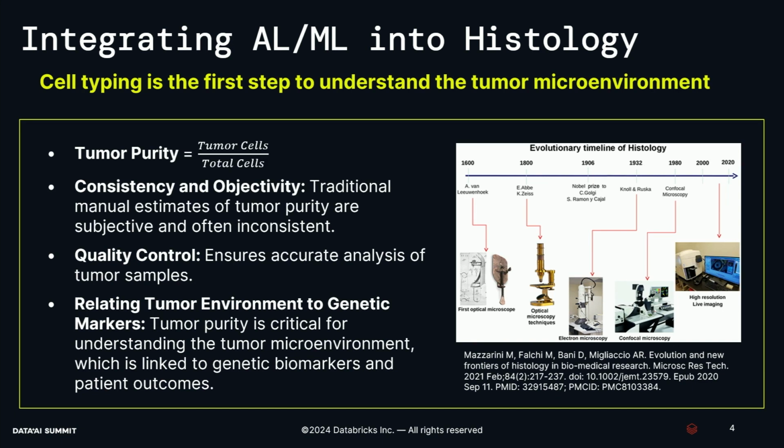And for us, we're trying to get into digital pathology and digital histology, and we're looking at how to get those workflows to happen. When we look at cell typing, it's really one of our first steps towards understanding the tumor microenvironment. And understanding the tumor microenvironment is how we understand how to get those immune cells, those lymphocytes, to attack our tumors and hopefully cure cancer.